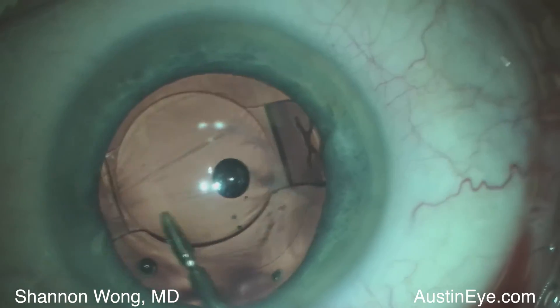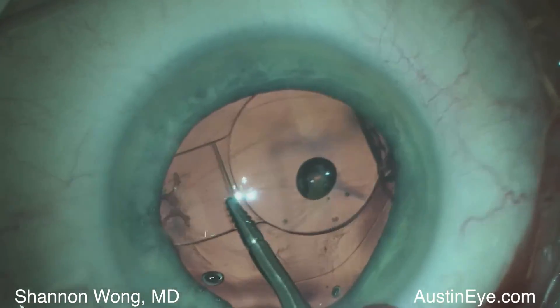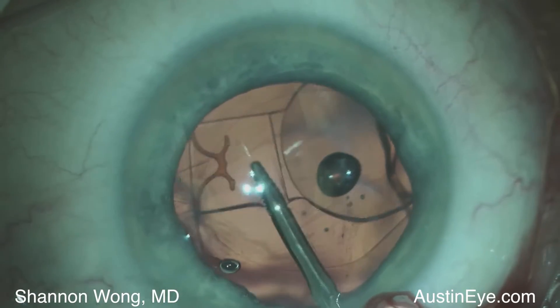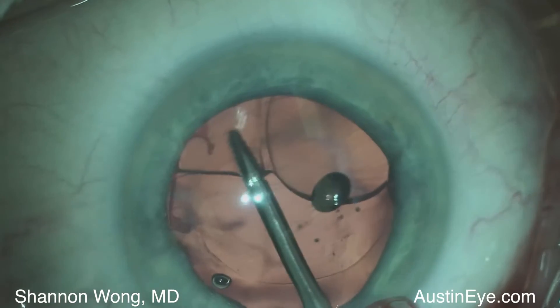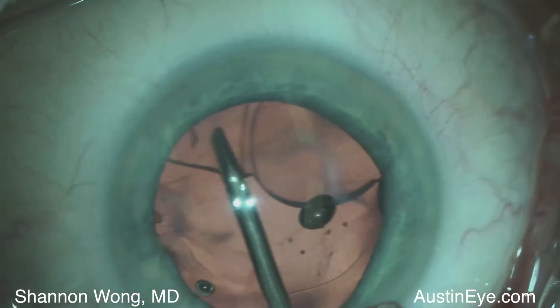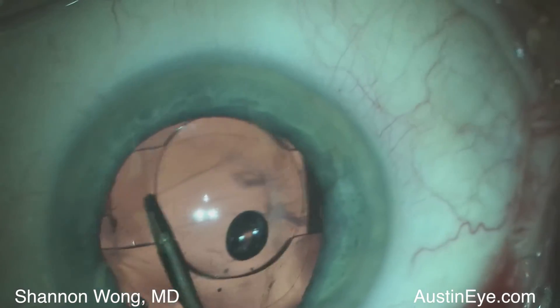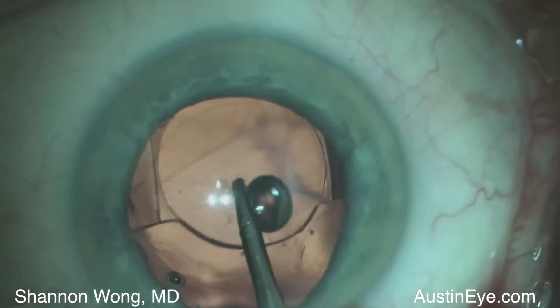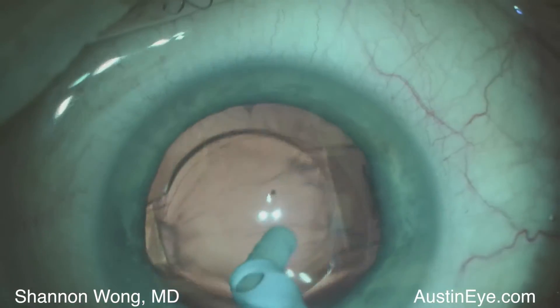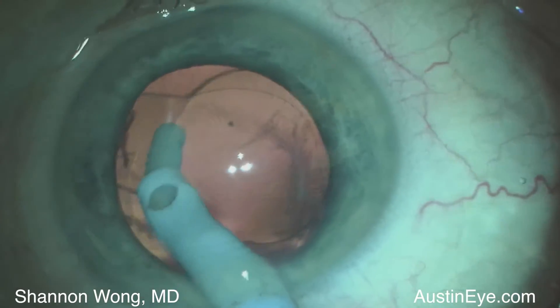The haptics on the left have a bit more fibrosis, but we're able to gently free each haptic from a band of fibrous tissue. We leave the Crystal lens in the capsular bag and then perform irrigation and aspiration and rotate the lens.